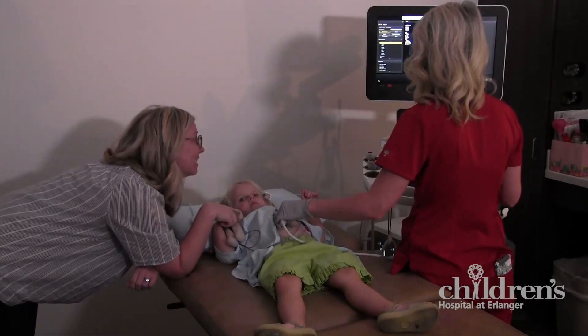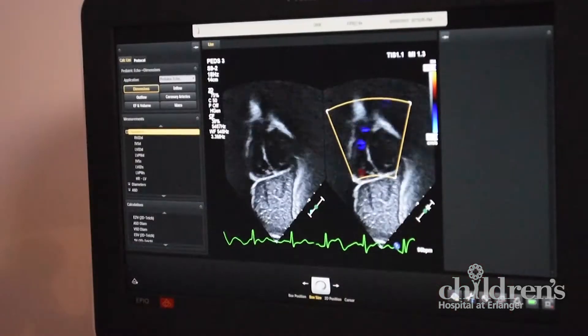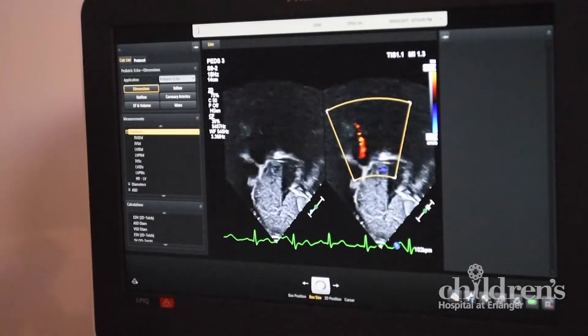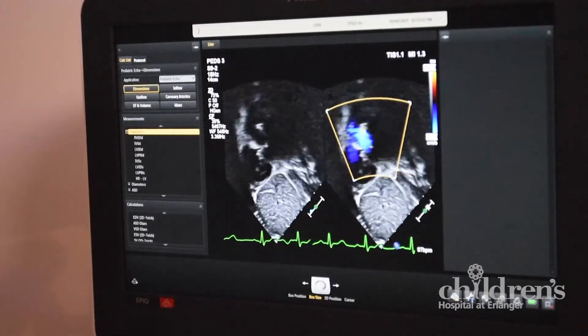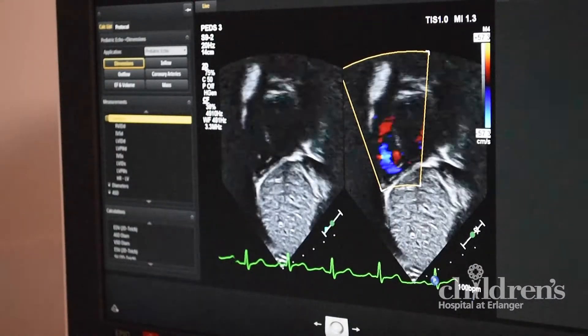The camera sends and receives sound waves, which bounce off the different parts of your heart. These waves travel electronically through a cable to our ultrasound machine, a computer that converts them to pictures of your heart. The picture changes when the sonographer moves the camera.